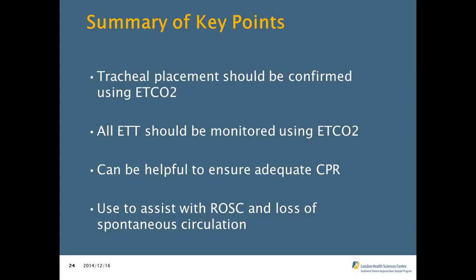It's a piece of the puzzle and something interesting we can add into our practice, especially with the ongoing research and changes in care. Hopefully it evolves. I think those are the biggest bang for your buck uses of capnography at this point in its infancy in the pre-hospital setting. So I think those are where you're going to get your most use from it.